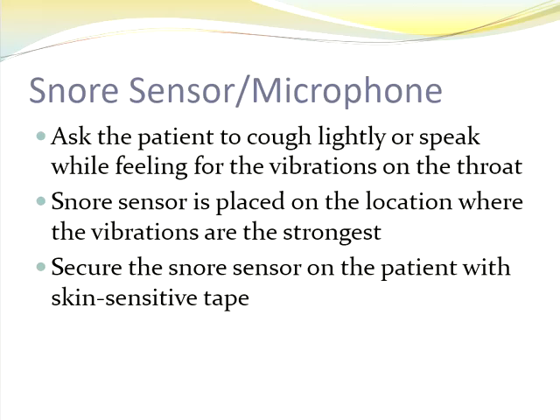For this one, I take care to avoid the artery, the carotid arteries, because if you place that snore sensor right over the artery, you're going to get a lot of the bounce from the artery versus actual snore. Always use skin sensitive tape for this one, and I always also actually use the adhesive remover to take it off, regardless of whether or not the patient has sensitive skin, because the neck is just very sensitive skin on most every person.